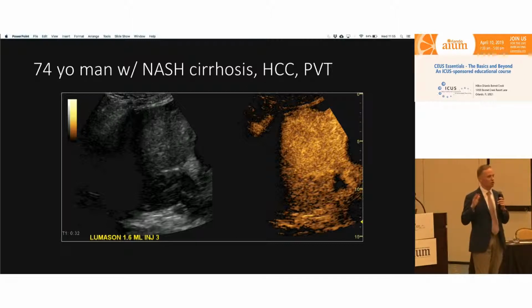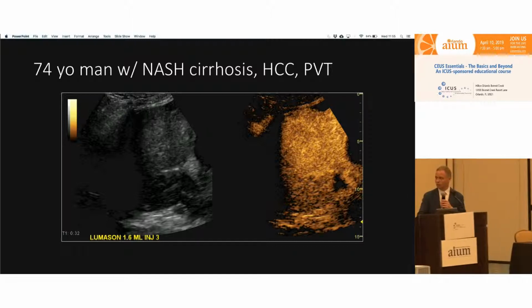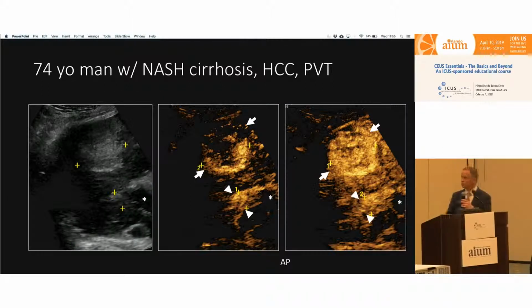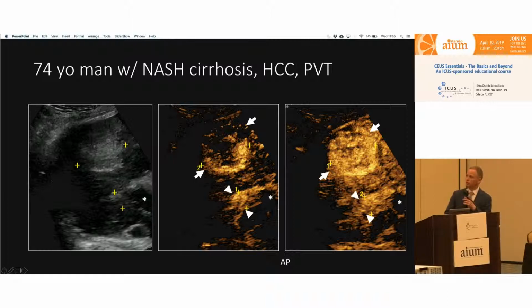So this ruins your life completely. So practice breath hold with them before you inject bubbles, and then about 10 seconds ask them to take a breath in, stay in the lesion, get the first 20 seconds of arterial phase hyperenhancement, and that will give you the best images possible.